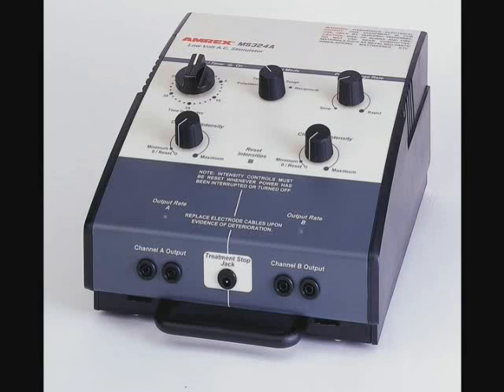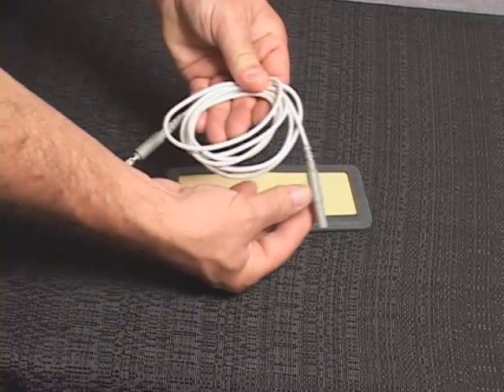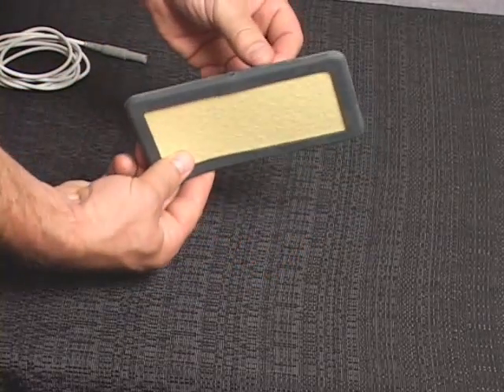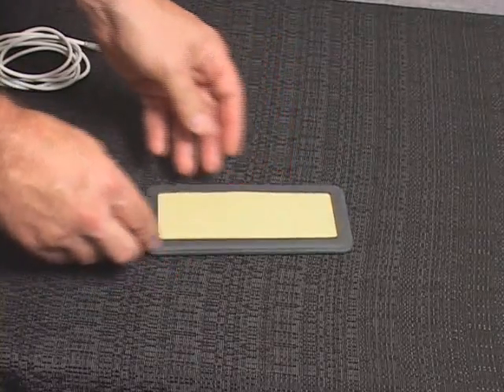Patient leads should always be checked for proper connection and damage or deterioration prior to treatment. Loose connections or damaged cables can cause low stimulation output, no stimulation output, or sudden irregular increases in output resulting in possible discomfort to the patient.